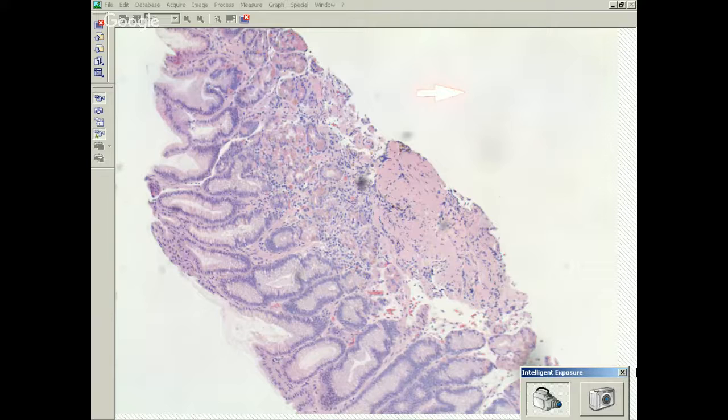Graft versus host. Graft versus host, generally, we see apoptotic figures. We might see active inflammation as well, but what we look for is apoptotic figures, which are actually very low, are normally not found in the stomach. So when you do see them in that setting, then it's suggested. This happens not to be a graft versus host.